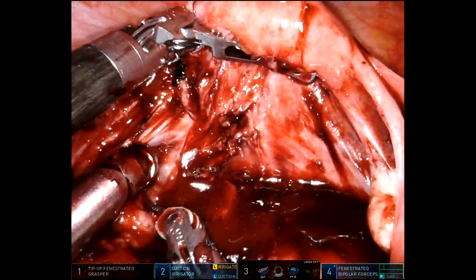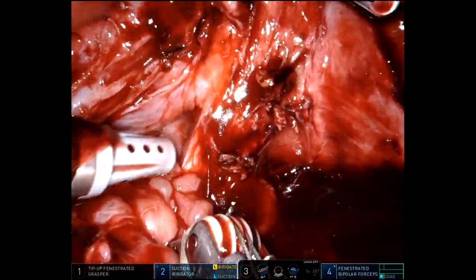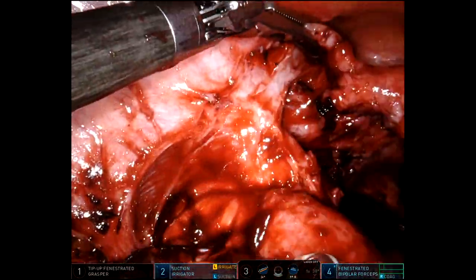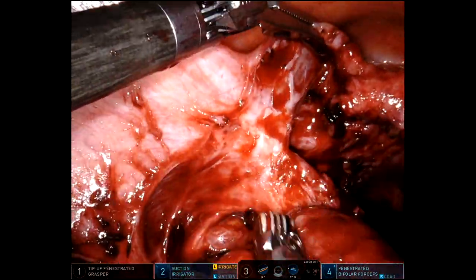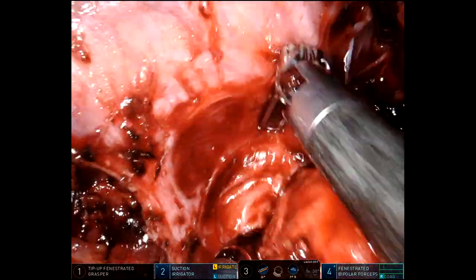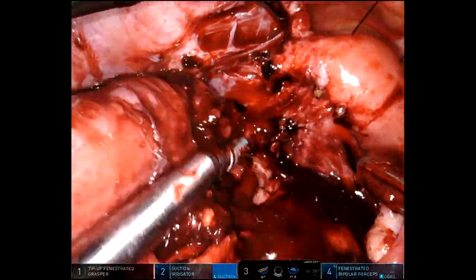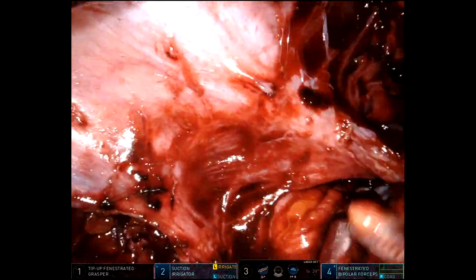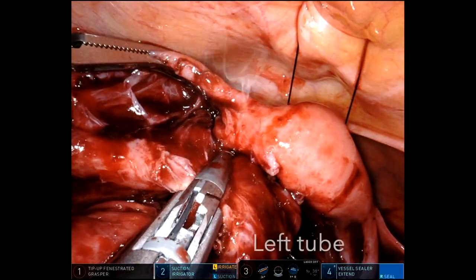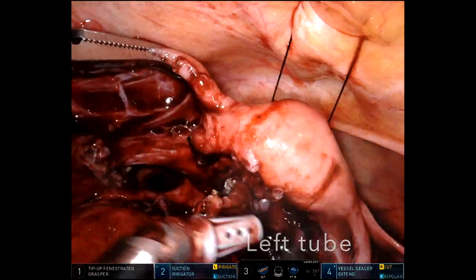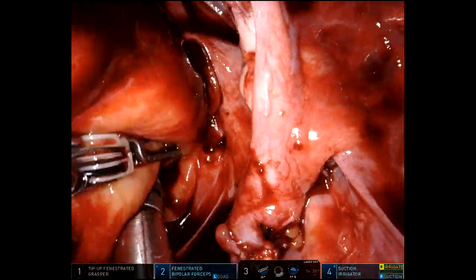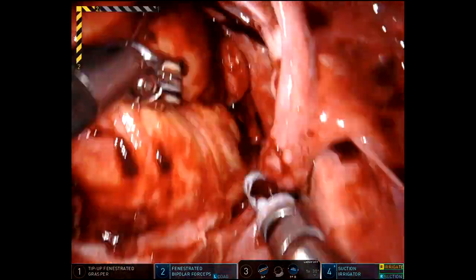Here is some granulation tissue associated with that fistula, and here I'm finally finding a plane lateral and inferior to the left fallopian tube. I can finally see the left tube and ovary stuck to the medial aspect of the sigmoid colon and I've gotten my suction device around that fallopian tube. I'm going to divide this and take the tube and ovary en bloc with the colon. This opens up the left pelvic brim where I was really stuck before and facilitates dissection.